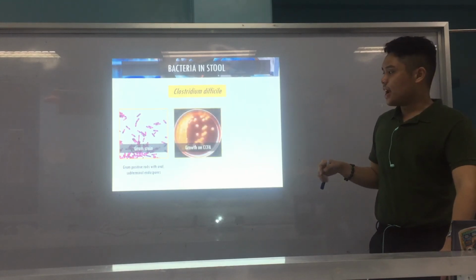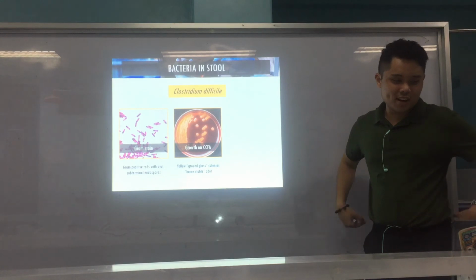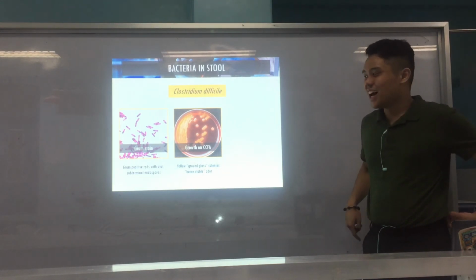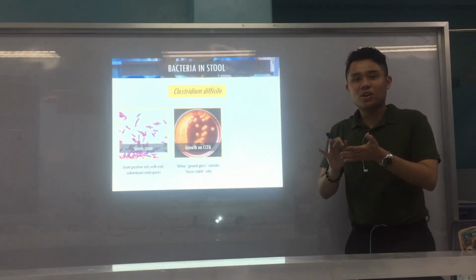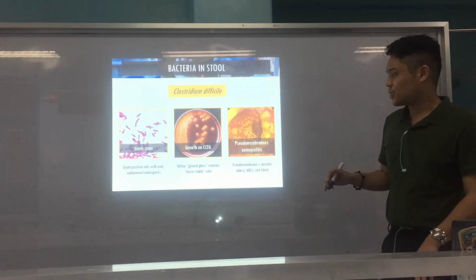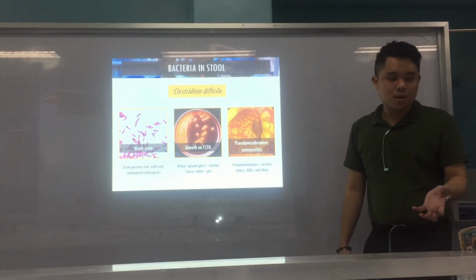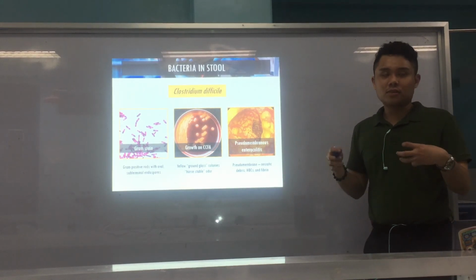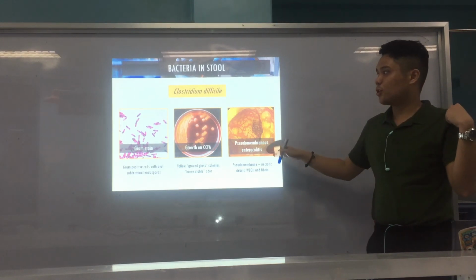And on CCFA, yellow ground glass colonies na muna siya, horse stable. So kanang iyang odor kimura kanana sa mga kabayo. Horse stable odor and ground glass colonies. So as you can see, ground glass. Mura siya sinaw na glass. And this is an example of pseudomembranous enterocolitis. Ang pseudomembrane contains necrotic debris, so mga namatay na tissue, WBCs, and fibrin. So again, this is caused by antibiotic, na too much na paghatag. So, kinsa antibiotic, clindamycin. So that's for Clostridium difficile.